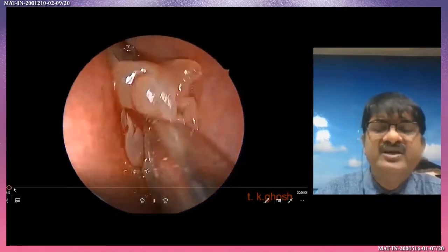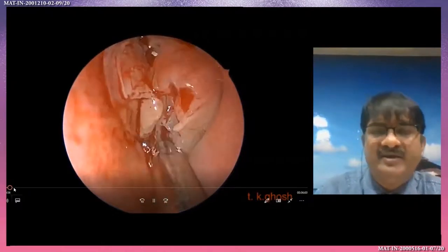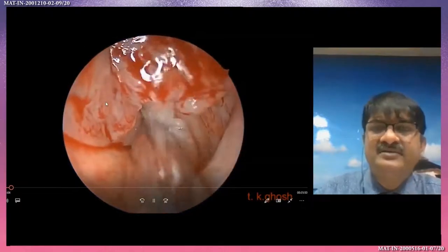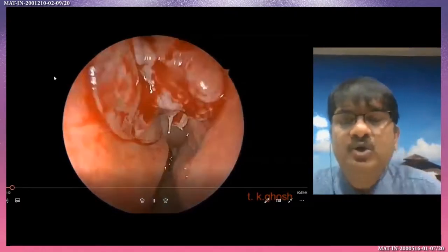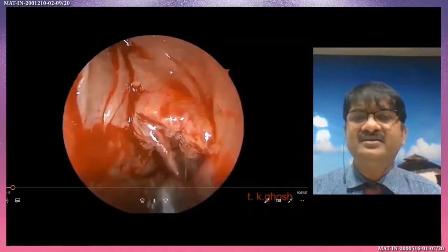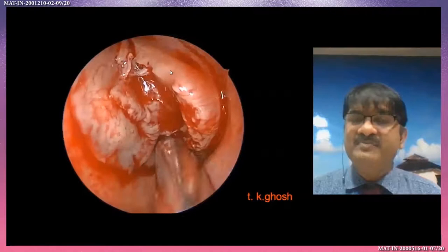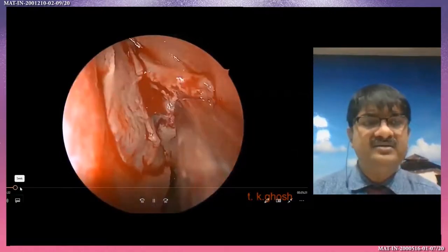With the microdebrider, I am reducing the bulk of the polyposis after delineating the anatomy. This is very important. I am all the time looking at the uncinate and medially the middle turbinate — laterally the uncinate, medially the middle turbinate. This is the most important zone. I am working through this part. Here is the axilla. Look here, this is the uncinate. All the time I am carefully first delineating the polyp and normal structure, then doing the same.